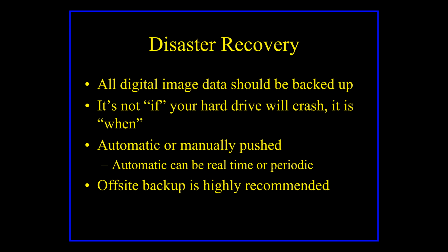Okay, so the last part that we need to talk about is disaster recovery. So again, like any computer system, it's not a matter of if your hard drive is going to crash, it's a matter of when your hard drive is going to crash. The images that you have in your practice are part of the medical record. By law, you have to keep those images for a specified period of time, which will vary from state to state. But in general, it's about 5 years at least that you need to keep the images in case something happens and somebody gets crossways with you.